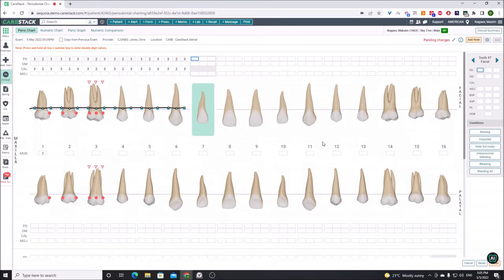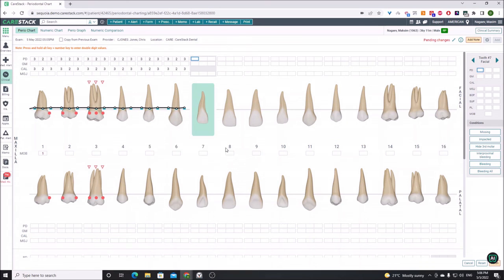We can see it goes right along and can chart all the various pathologies and conditions. We can also jump around the chart to navigate. That's it — it's very easy to use.